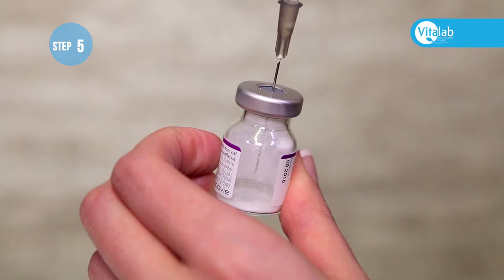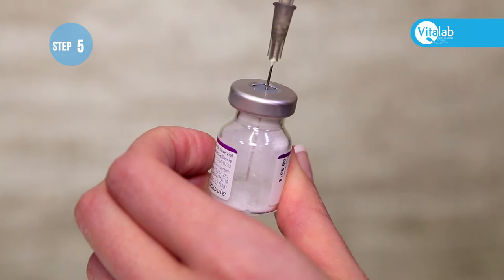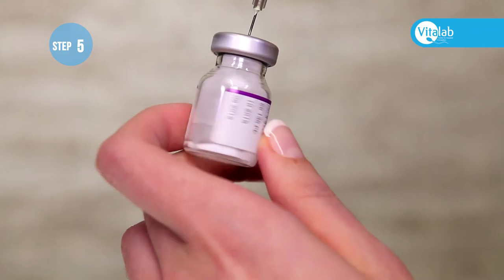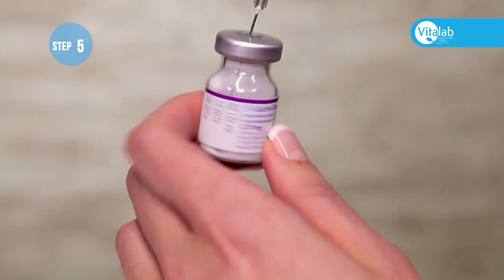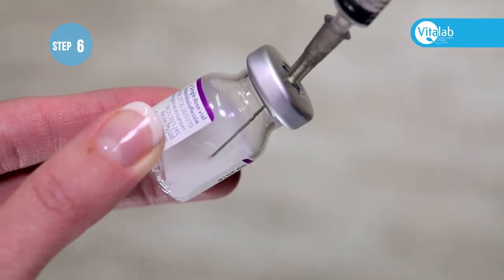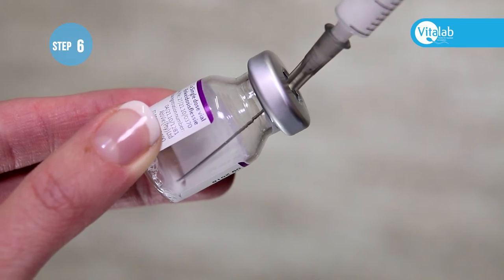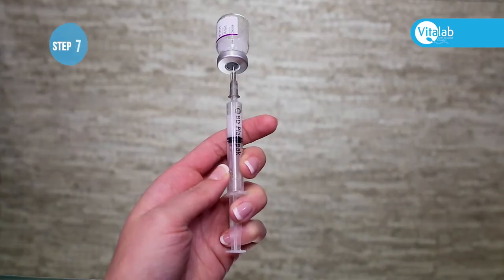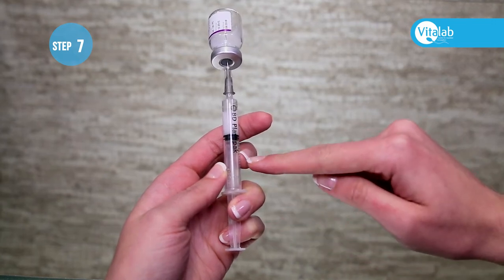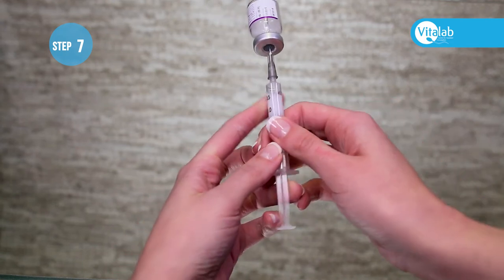Gently push the water into the vial and swirl the vial to ensure all the powder is dissolved. The liquid will not go clear — it will remain milky in color. Push the needle into the bottom corner of the vial and draw all the medication back into the syringe. Turn the vial upside down, making sure to hold on to both the plunger and syringe together in order to prevent the fluid from being sucked back into the vial.